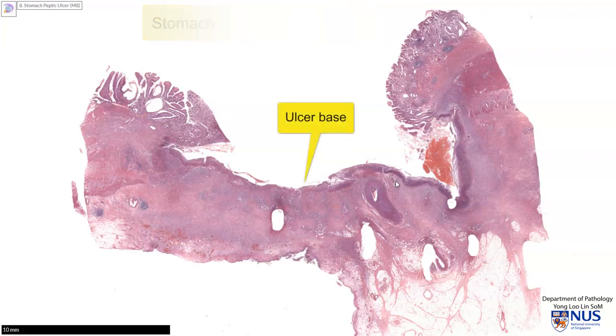In the center, you will see that there is a crater where there is a defect in the gastric mucosa, and this is the region of the ulcer.